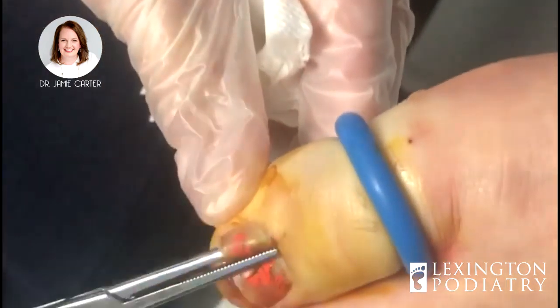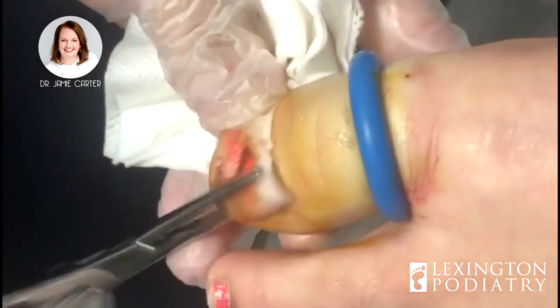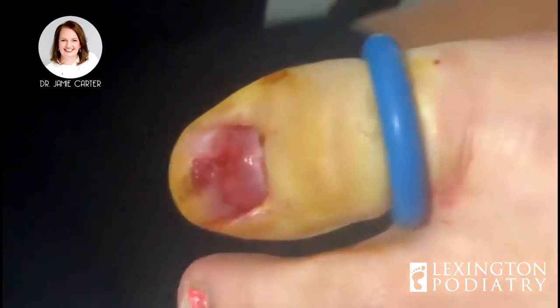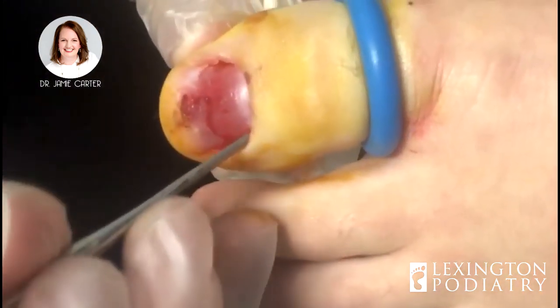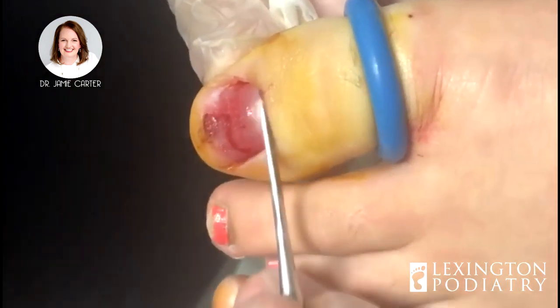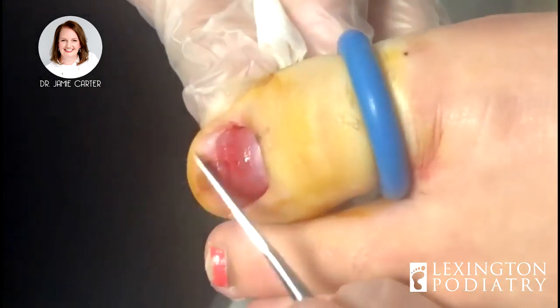Hopefully it's going to come off — there's one side and there's the other. Now we're going to inspect the skin underneath because that's what I was really worried about: to make sure there are no big cuts in it. And there are not, so that's wonderful. It had already started to heal back in here, and the cut is resolved up here at the tip of the toe.